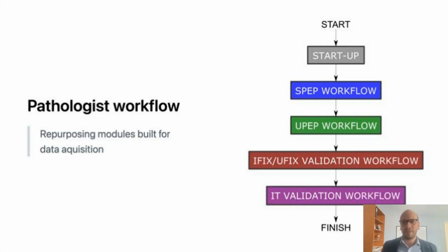And I'll just highlight up front, this is probably the major limitation of our new workflow, is that we're using a software that was not designed for the pathologist's interpretation. It was designed for data acquisition, and therefore the organization of the software is centered around these different modules corresponding to the different assays. This was not insurmountable. We just had to explain to the pathologist how to navigate through the different modules to interpret the various studies.